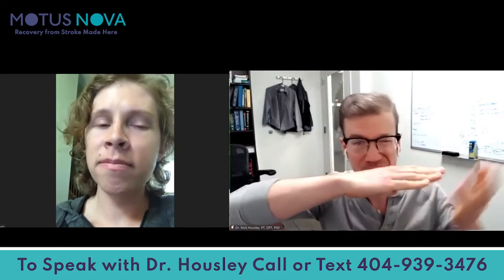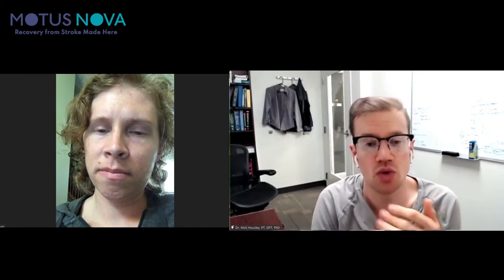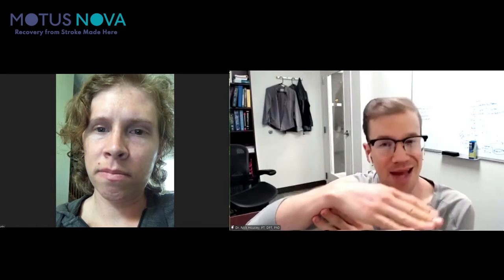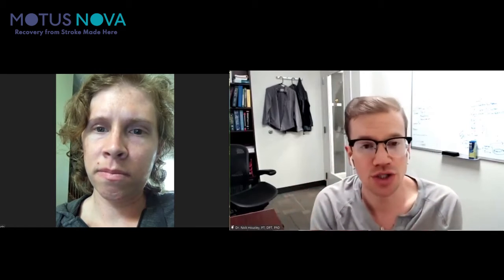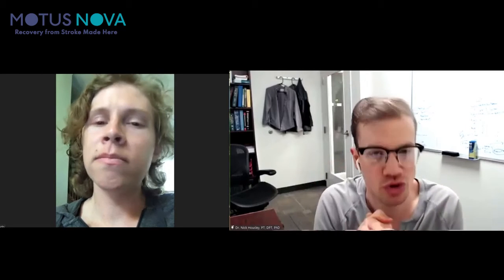And so it's helpful to kind of differentiate this when you think about the values, right? Our convention is that 0, or basically neutral, is 0. And anything below this is negative. Anything above this is positive. So extension is positive and flexion is negative. If, for instance, you are in a position where you're in what's called a flex position and a negative value, and you move up into a less negative, closer to 0 value, yeah, you're extending, but your positions are just shifted. Those distributions, rather, are shifted.